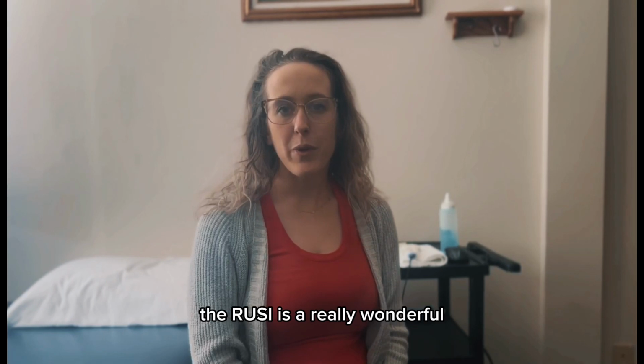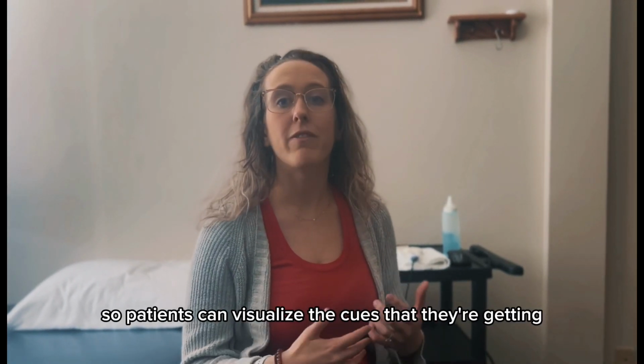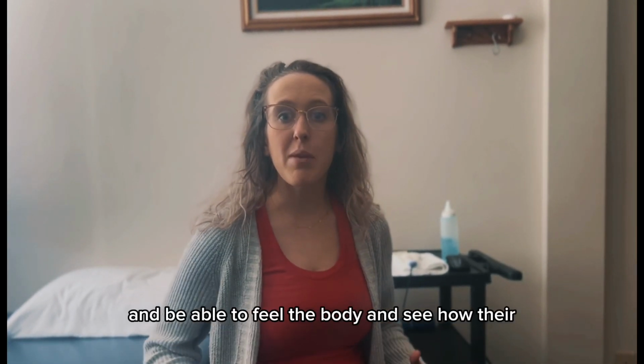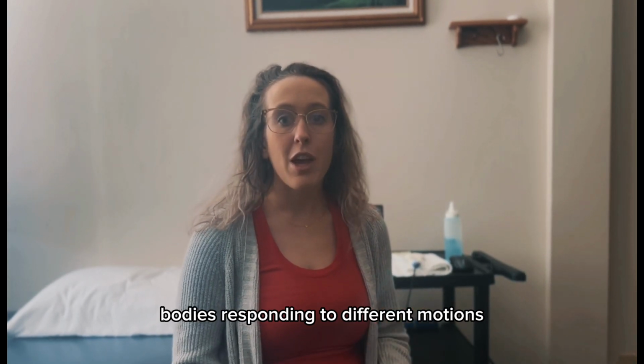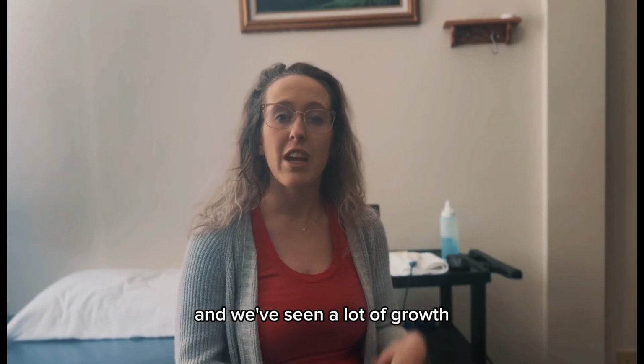The RUSI is a really wonderful neuromuscular retraining tool that we can use so patients can visualize the cues that they're getting and make those changes and be able to feel the body and see how their body is responding to different motions.